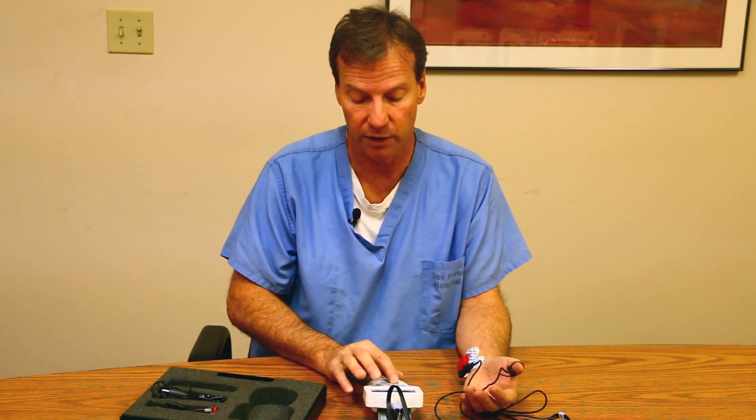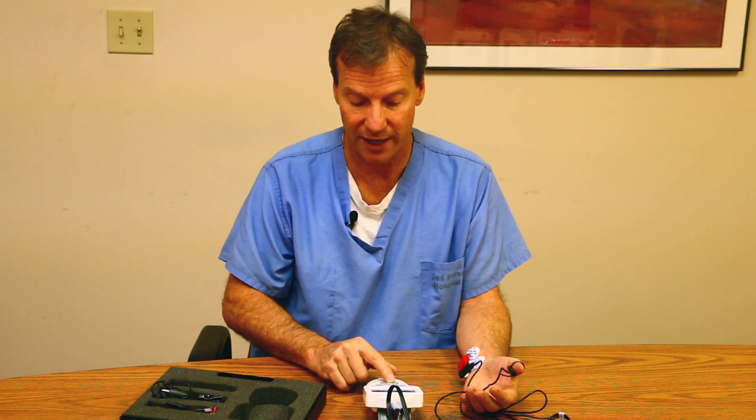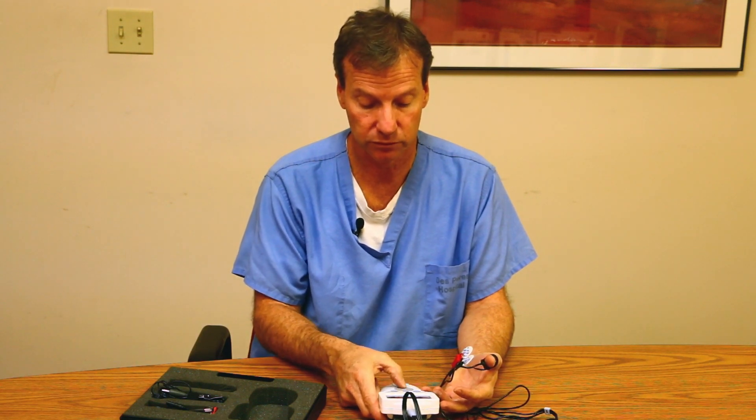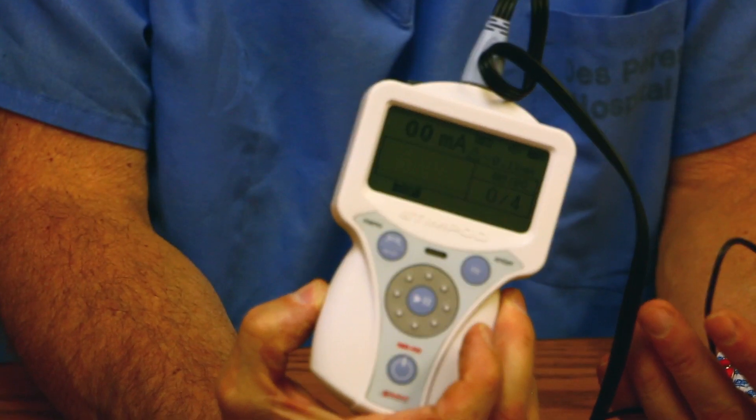I'm going to simulate by lowering the stimulation so that I can show you what it would look like if someone was completely paralyzed. The monitor showed zero of four stimulation — that would be a patient that's completely paralyzed.